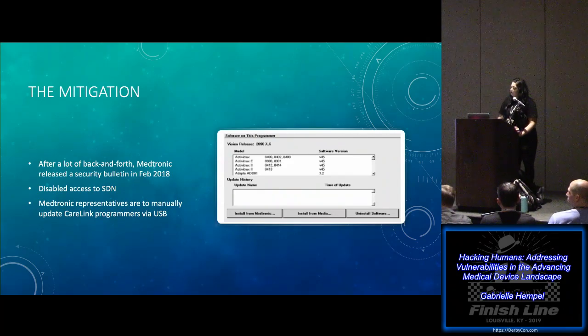Medtronic disabled the network-based software update mechanism, including the VPN and HTTP subservices. Users were instructed to obtain and apply updates via controlled USB devices. It was also recommended that users minimize network exposure for all control system devices and ensure that they were not accessible from the internet.